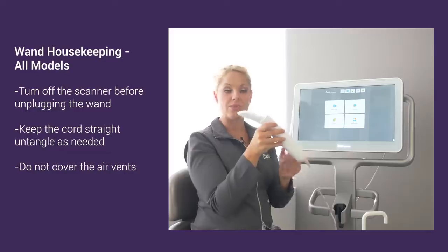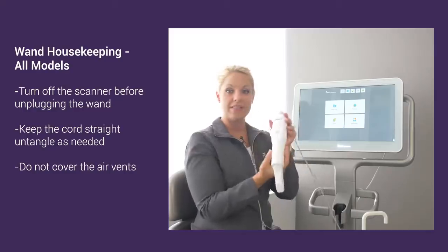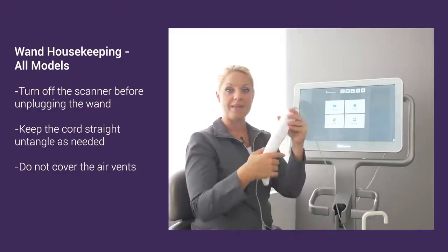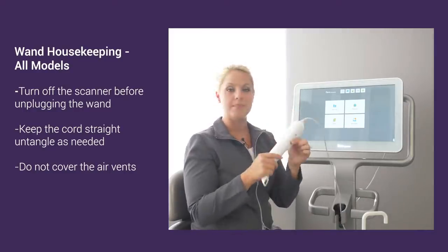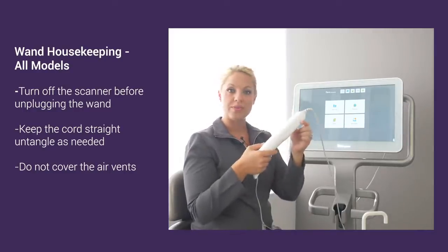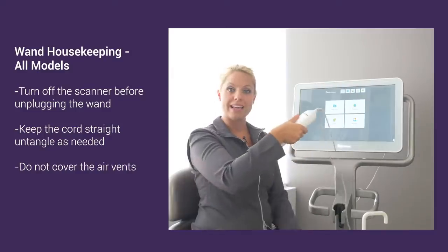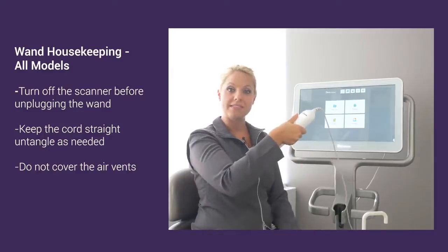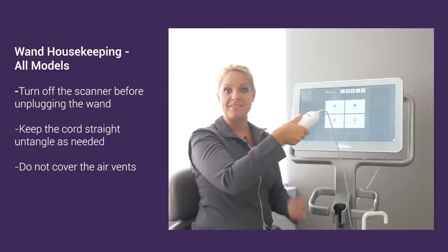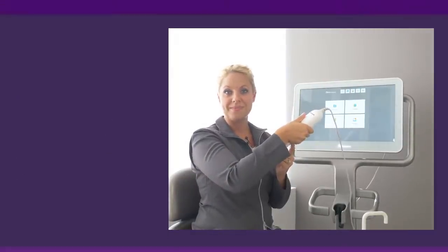With the wand, we have air vents here at the top and bottom. Make sure that when we're scanning, we're not holding our hand on top of the vents to prevent the wand from overheating.